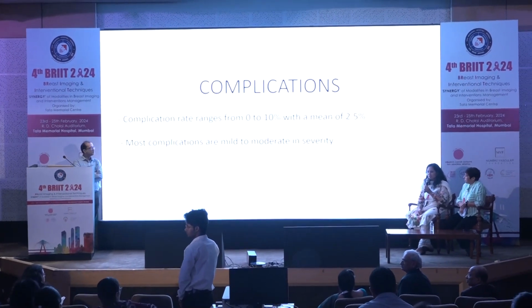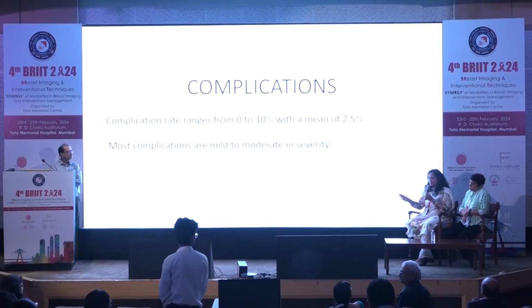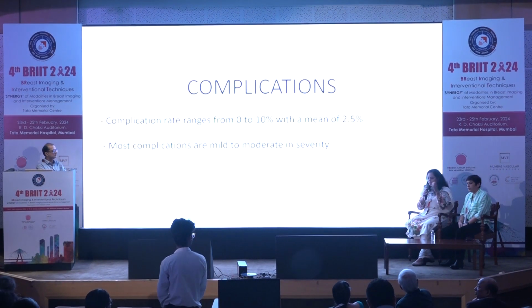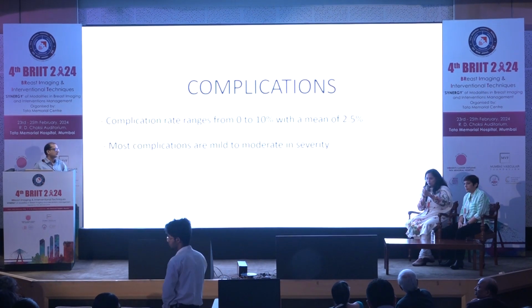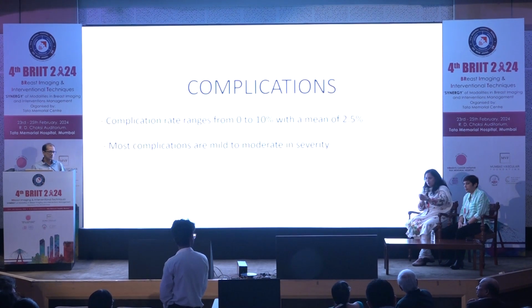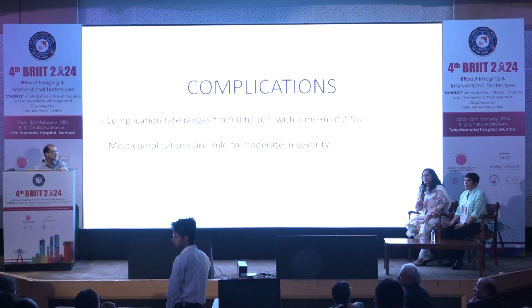What I practice is the person who assists me keeps the marker ready, and I don't remove the hand where I had kept the probe. The probe hand doesn't move. I only remove the vacuum probe outside. The ultrasound probe hand still remains in the same place, and my assistant gives me the marker and I inject it. So my hand does not move for a smaller lesion. That's how practically it should be done.